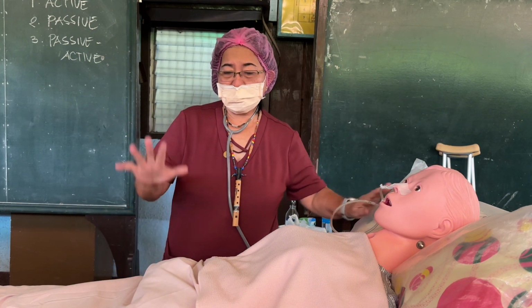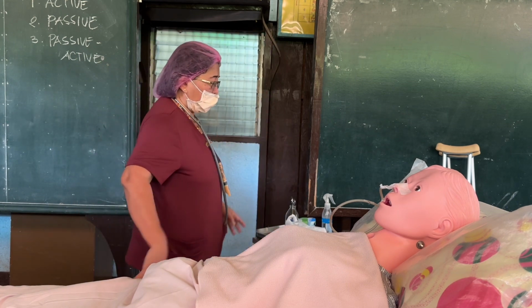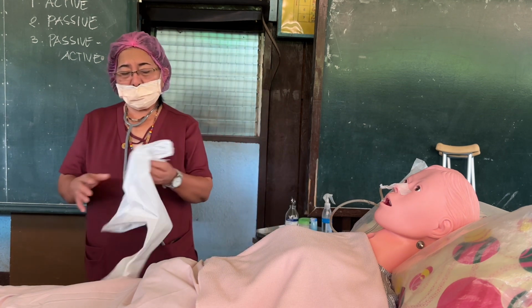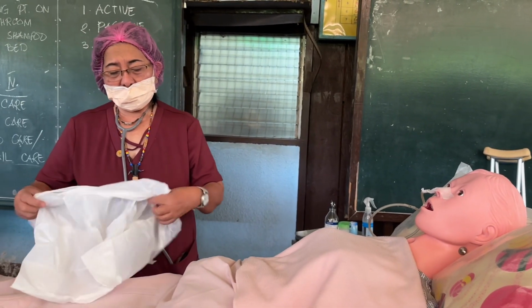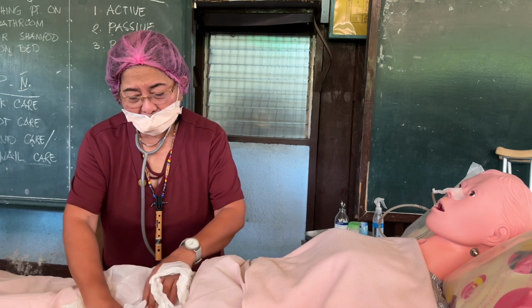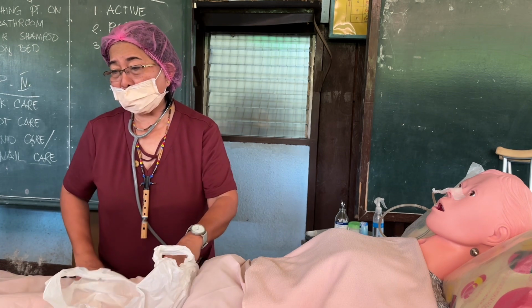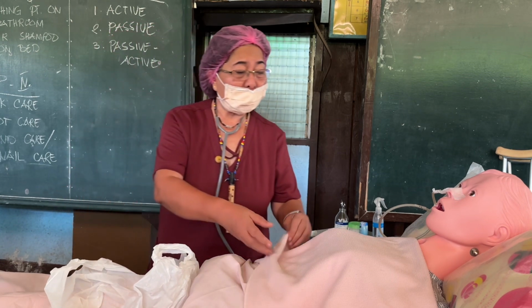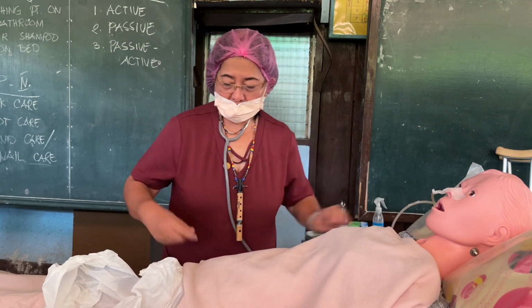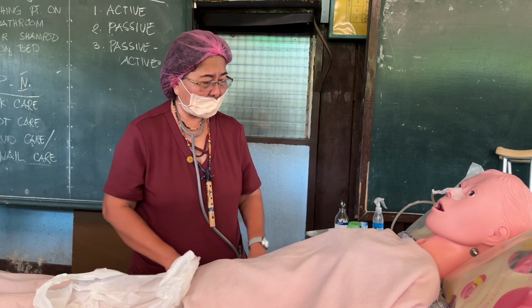Okay, so confirmation again, five ways to confirm, with vital signs before and after the procedure. I'm going to get a waste receptacle, class. Remember the psychological effect. Anything that drips from inside our body is very irritating and has an emotional, psychological effect on a person. That's why, when you remove the tube, be sure to hide what you took out so the patient cannot see it or smell it.